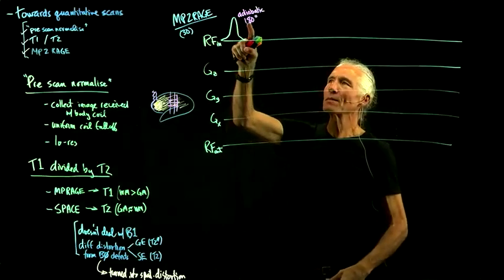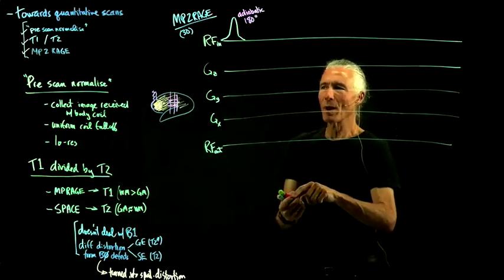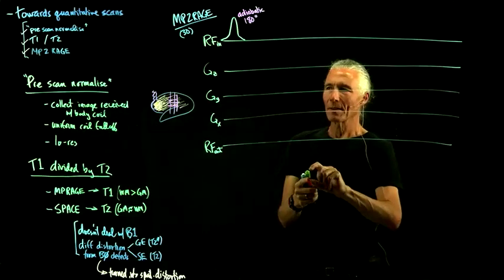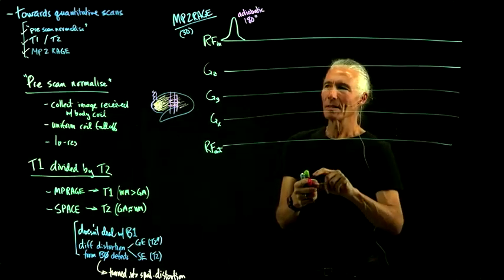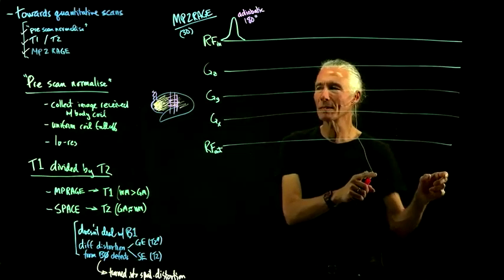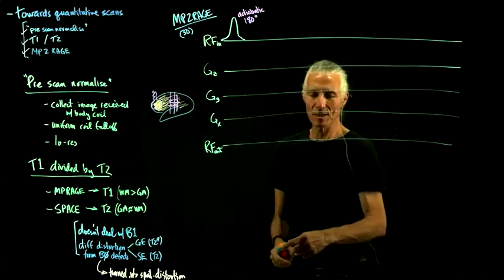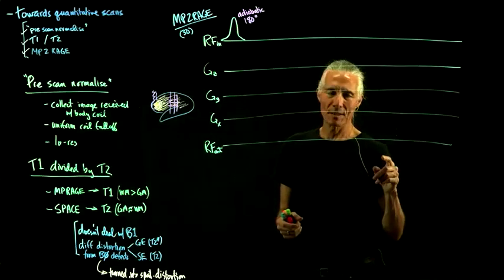And what's an example of a pulse like that? Instead of just playing out a little blip of a pulse, like a sinc pulse, where you make little variations in the transmitter amplitude, and when you Fourier transform it turns into a band of frequencies, if you're trying to invert, you can just slowly ramp the frequency of the transmitter.